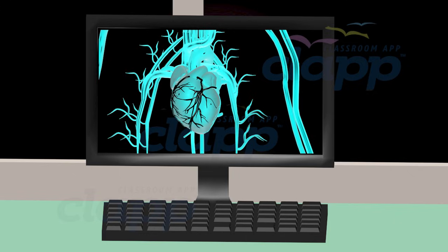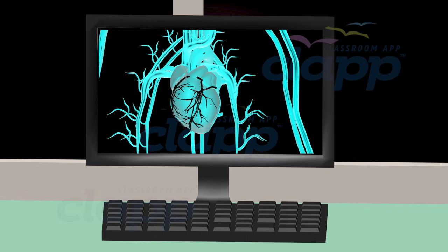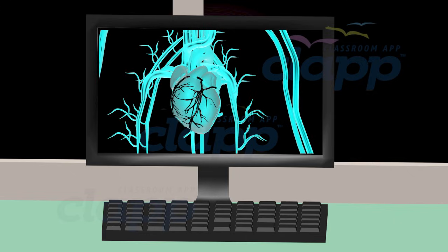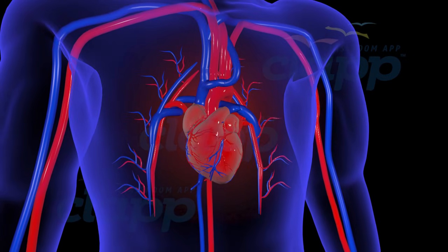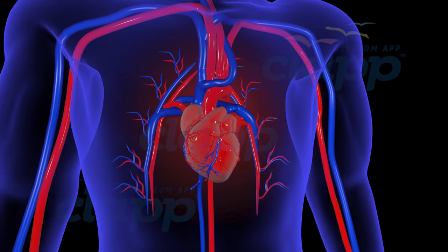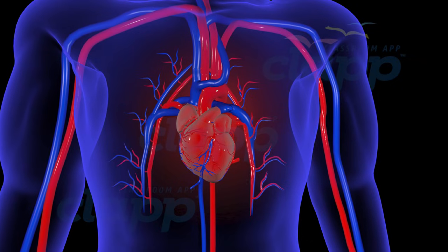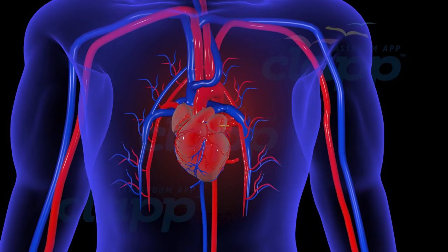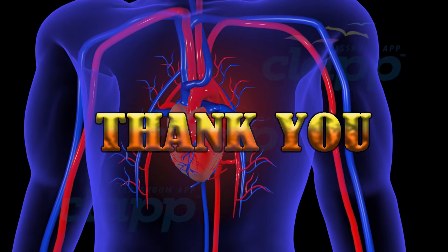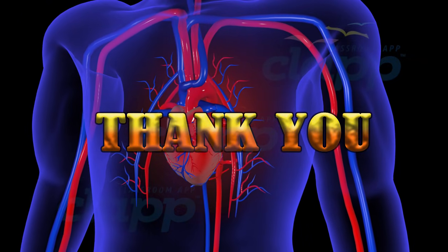Once the angiogram is complete, doctors can analyze the images to determine the best course of action, whether it's medication, lifestyle changes, or procedures like angioplasty or stent placement to restore blood flow. And there you have it — an angiogram is a vital tool in the field of medicine, helping doctors diagnose and treat cardiovascular conditions, ensuring patients can lead healthier lives.